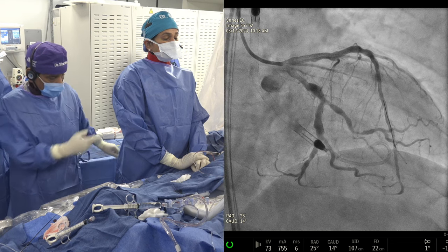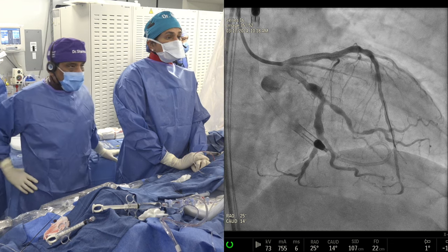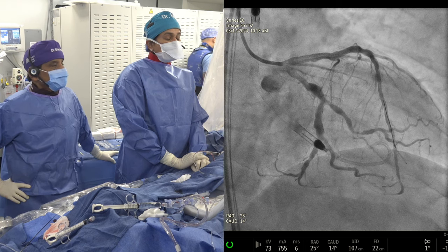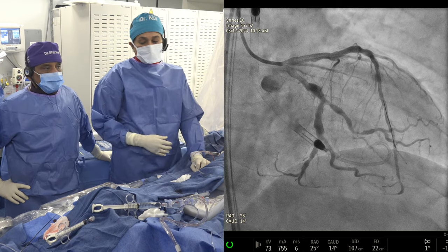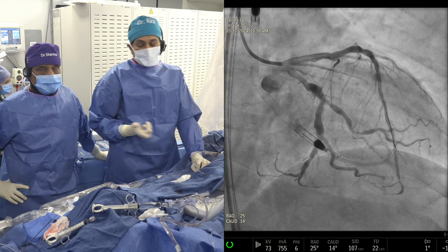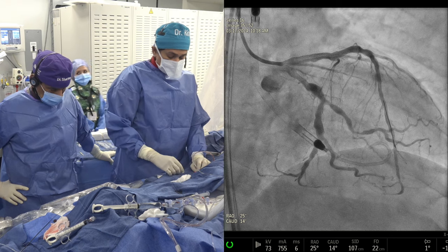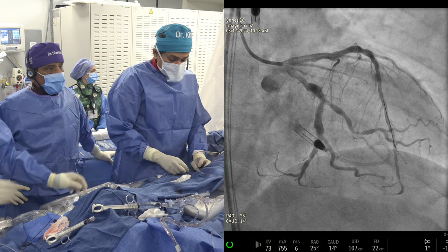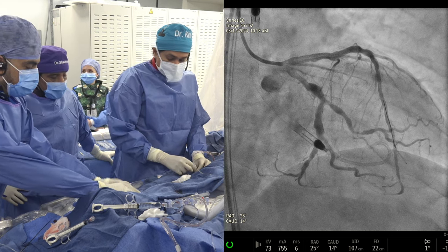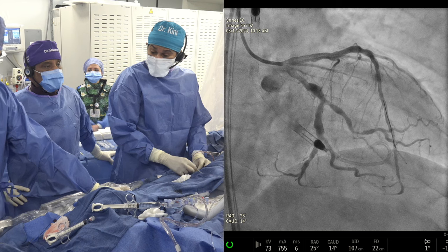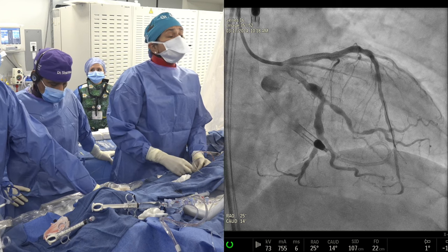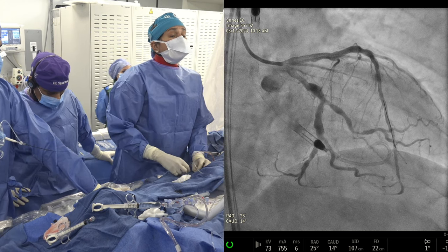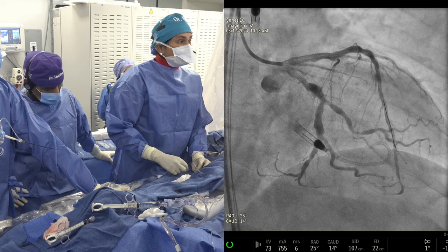What are you going to do next, Dr. Kenny? We are ready for the OCT. We placed a 4.0 stent and post-dilated with the 4.0 at 20 atmospheres. We'll confirm with OCT whether everything is well-optimized and whether we need additional post-dilation. Do you post-dilate routinely? Every calcific lesion — yes.